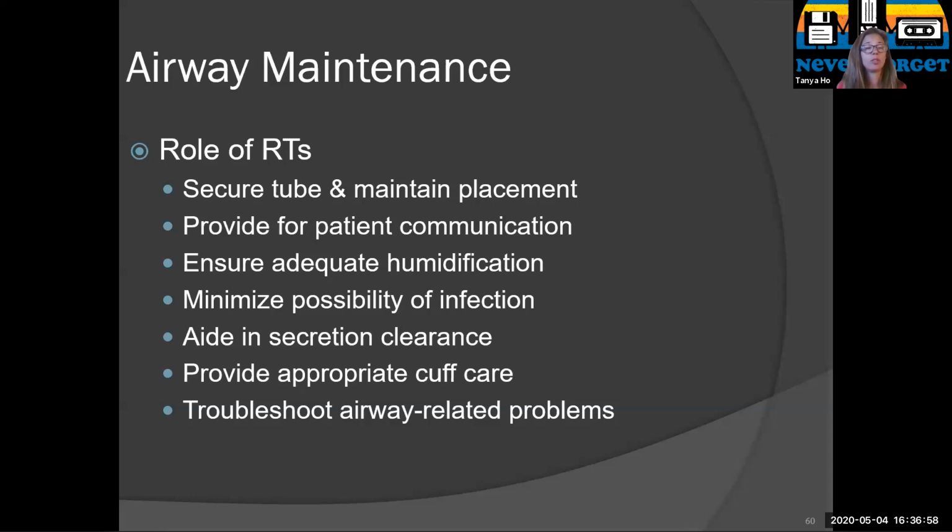Okay, we have everyone hooked up to an inline suction catheter for the most part, and so we will perform suctioning as necessary. We do not routinely instill normal saline for suctioning. We do not want to do that. That does not help at all. And cuff care, and then we're going to troubleshoot any type of airway problems.